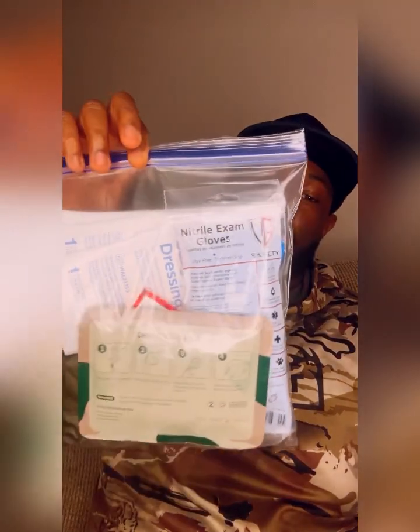Everything is inside this large Ziploc bag that you can keep in the car. We're not worried about aesthetics — yes, you can go buy a cheap canvas bag on Amazon at some point, but this is still very much waterproof and sealed tight, protecting your belongings from any water or liquid that could get inside.